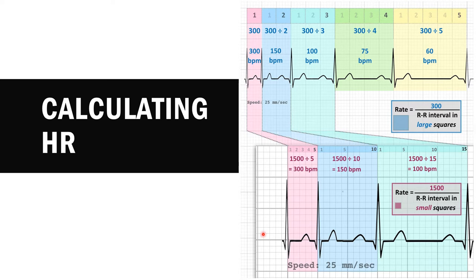If you are counting the number of small squares — which is more precise — between QRS complexes, you divide 1500 by that number. If you look at the EKG given, there are about nine small squares between two QRS complexes. So 1500 divided by 9 is about 166 beats per minute. This EKG has a heart rate of about 166 beats per minute, which is more than 100 beats per minute — one of the correct answers.